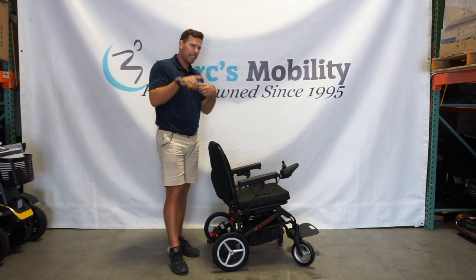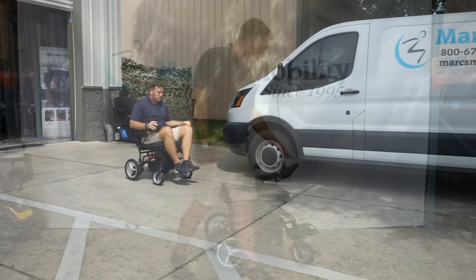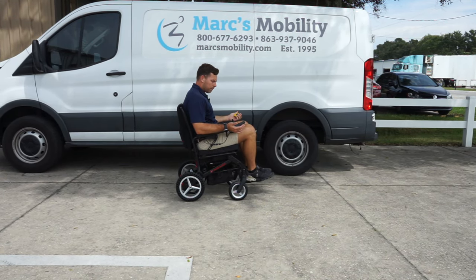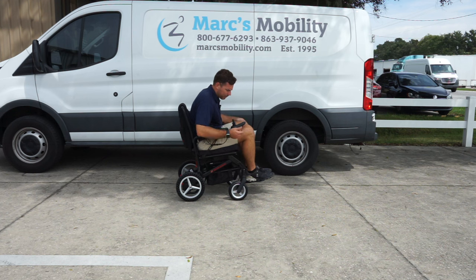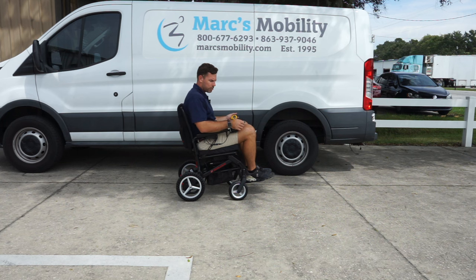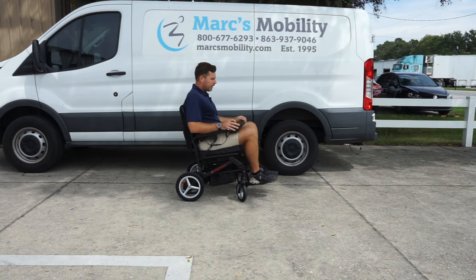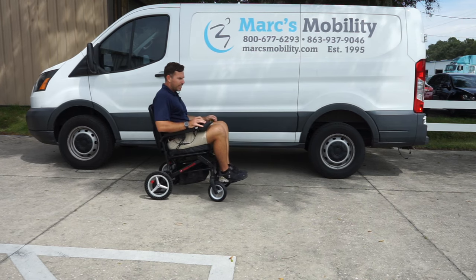Now I'm going to drive this outside and take it through the grass to see how this compares to other things on the market. I'm six foot tall, 220 pounds, so you can see how I sit in this unit. I don't really see any issue. I think if the footplate had a little bit of depth and height adjustability that might be a slight upgrade, but they do have the Travel Buggy City 2 Plus that does have those features. Overall, it's a very comfortable unit with a nice high back support. The acceleration is not as fast as on a few other small travel units, but comfort wise it is very nice.